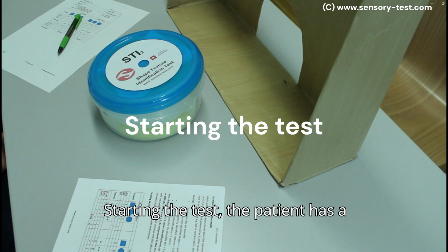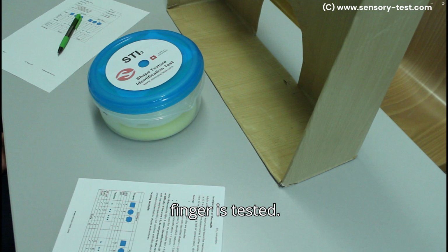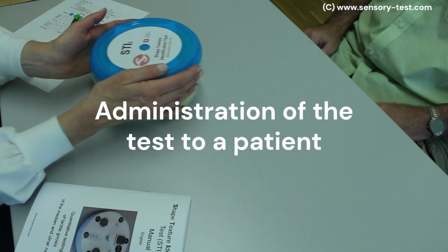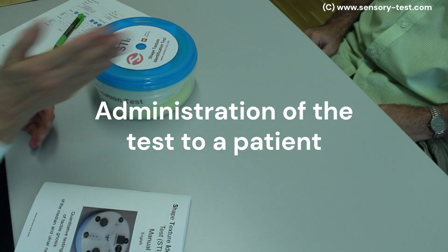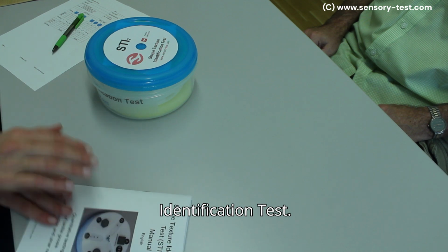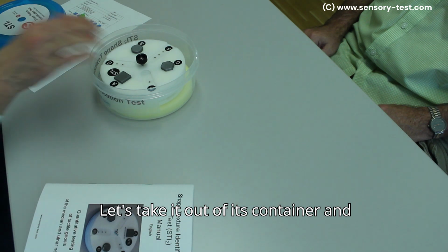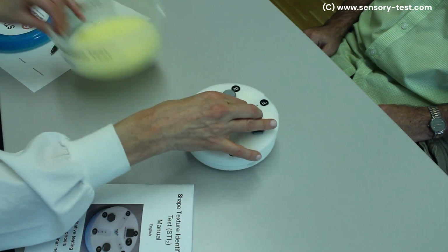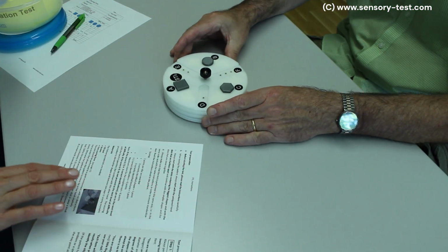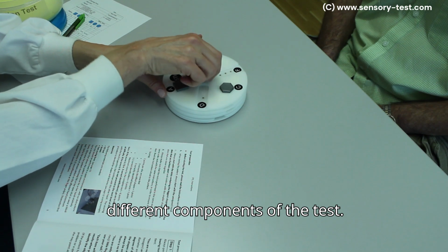Starting the test. The patient has a median nerve problem, therefore the index finger is tested. Today, we are going to do a test to measure the sensibility in your injured left hand. This test is called the shape texture identification test. Let's take it out of its container and show it to you. Let's take it apart to show you the different components of the test.